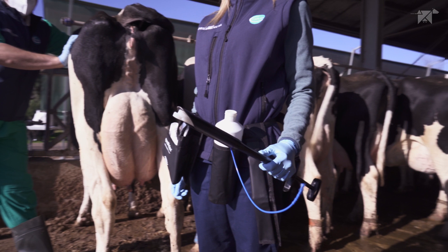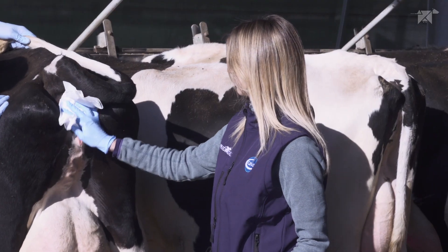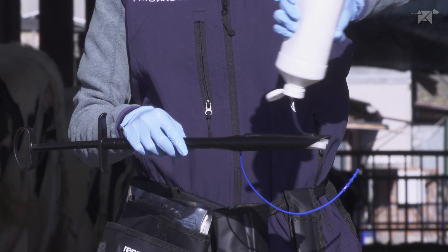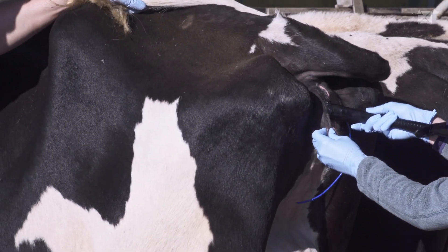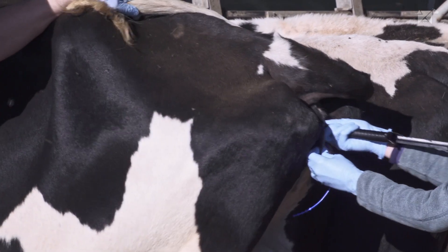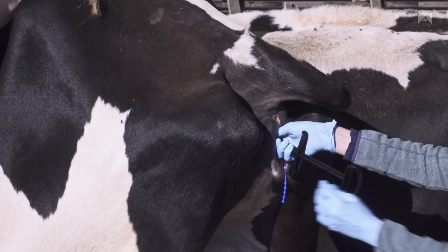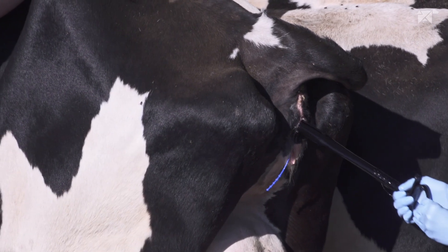Now our colleagues are going to demonstrate an alternative way to apply Predelta. After having wiped the vulva, we apply lubricant on the applicator. With the first hand we introduce the device. When we reach the fornix we rotate the applicator, and with the other hand we press the plunger to release the Predelta device in the vagina.